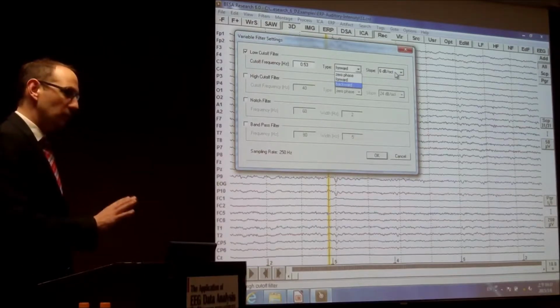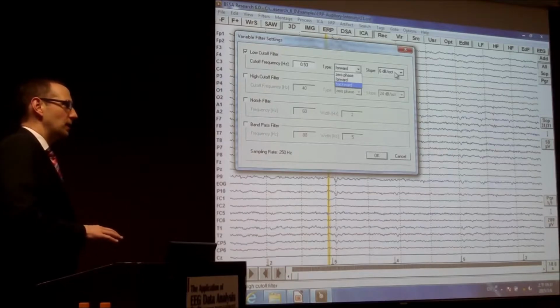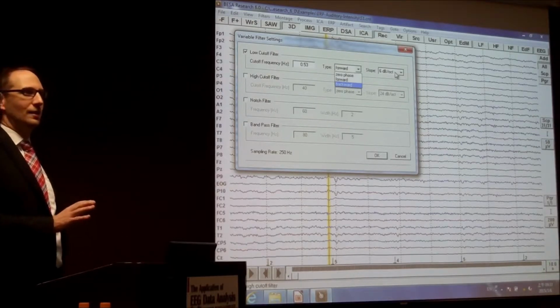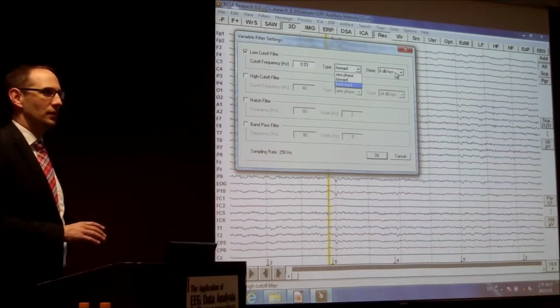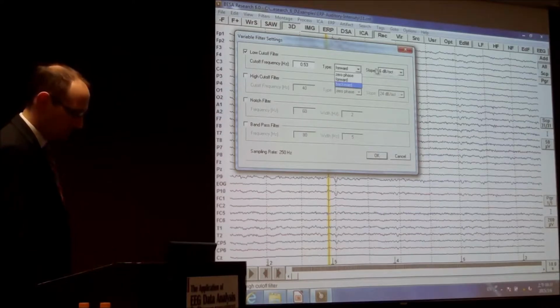That's very important, and I will show you afterwards that a lot of people think about filtering that it's not doing much to the data. In fact, it's distorting your data. As soon as you start filtering, you distort data. I will show you afterwards. Okay.